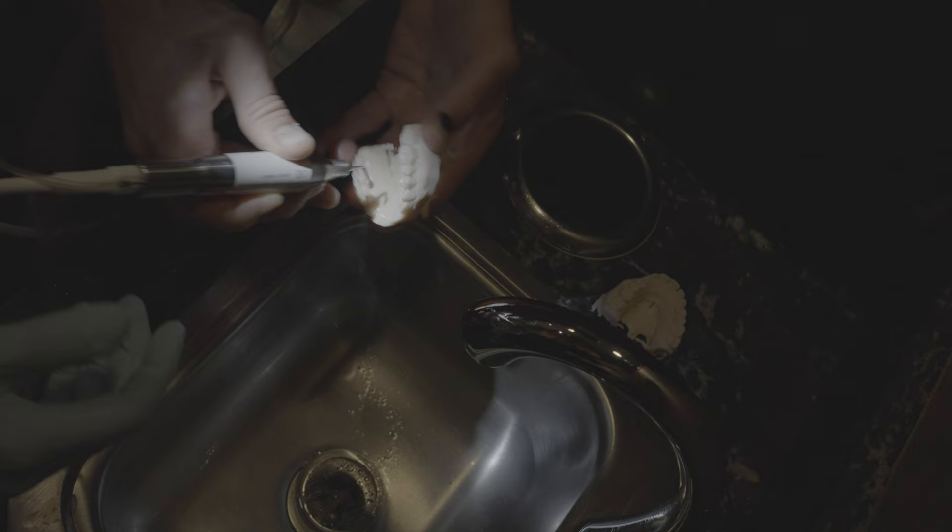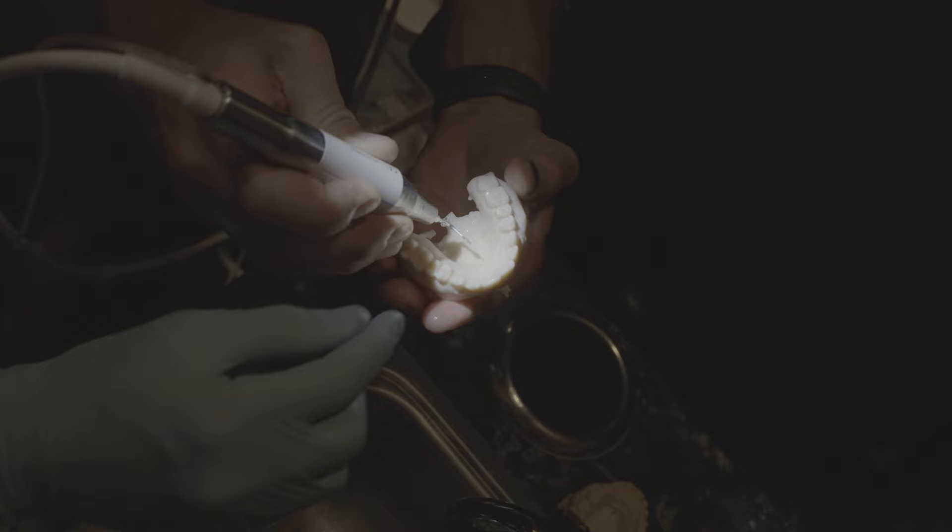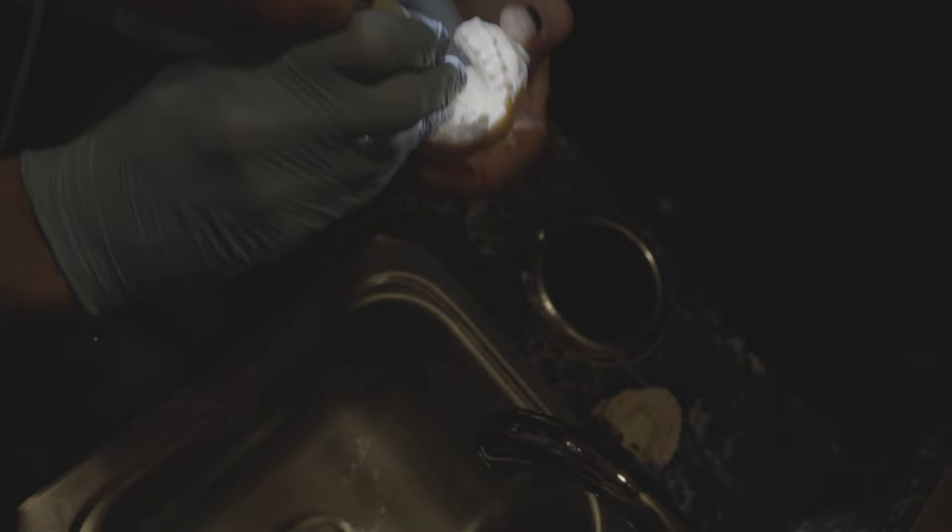You're really wanting to go... you don't want to go any harder than what you have. Just depth-wise, you want to go just the size of this blade — maybe just a millimeter deeper than that.